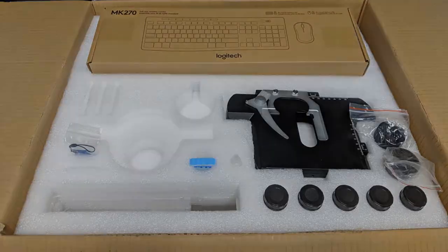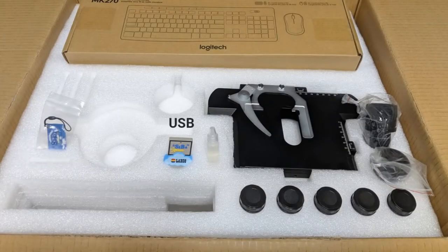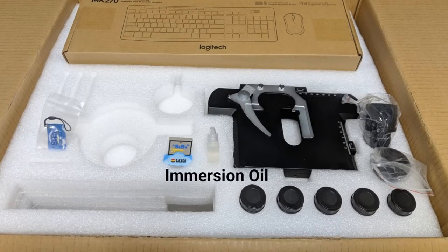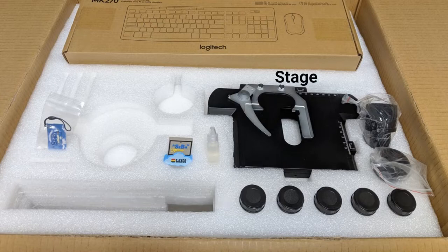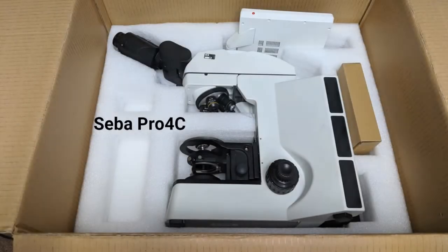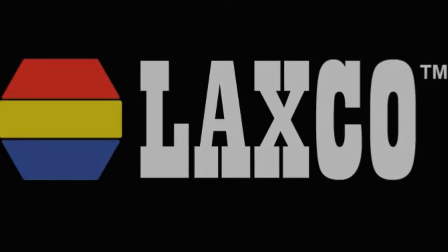Your packaged components should include your SEBA share card, a USB, immersion oil, empty objective holders, a stage, eyepieces, a mouse and keyboard, your SEBA Pro 4C, and your power cord.